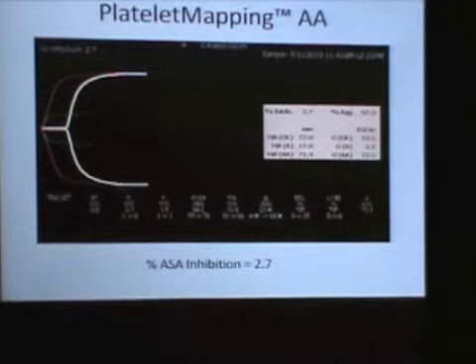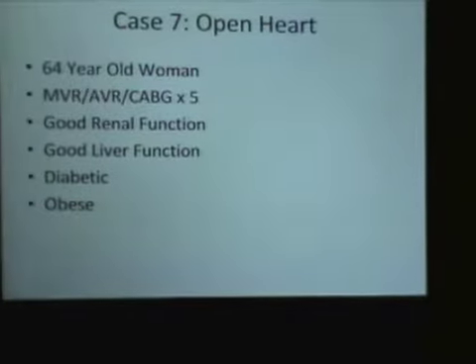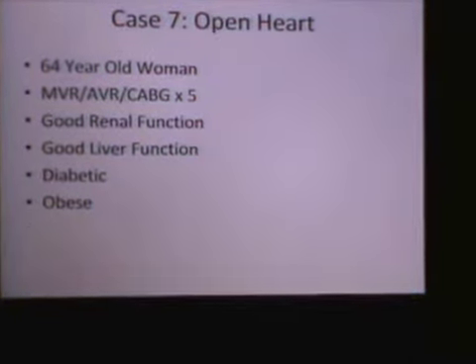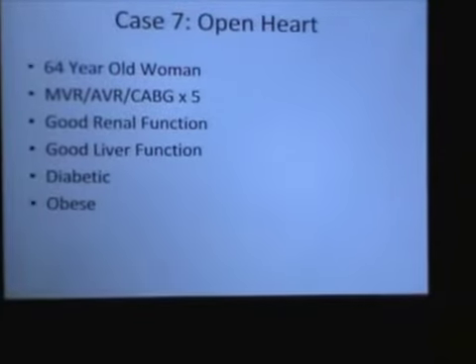And when these patients come in to the ER, that's a great time to order the platelet mapping. Because the surgeon already has that information by the time he gets the call. And you guys don't order that. More than half these patients can go to surgery virtually immediately. Guaranteed.